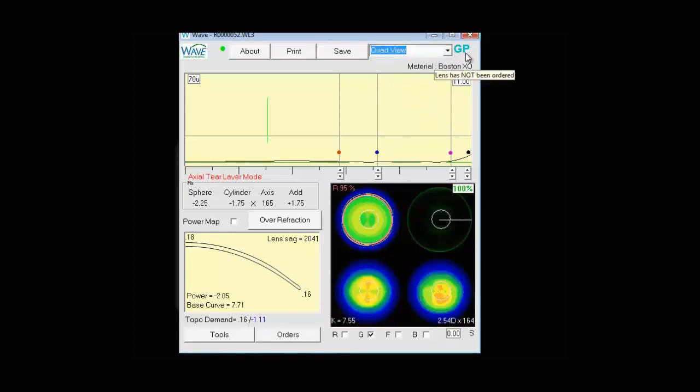To the right of that, you'll see the GP logo. If you hover over that, it will let you know if this lens has been ordered or not. And if it had been ordered, on what date it was ordered. And directly under that is the material that the lens is currently in.